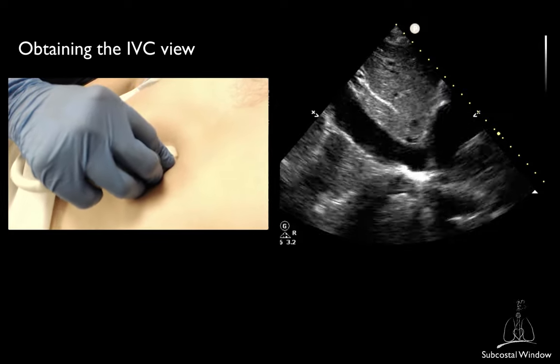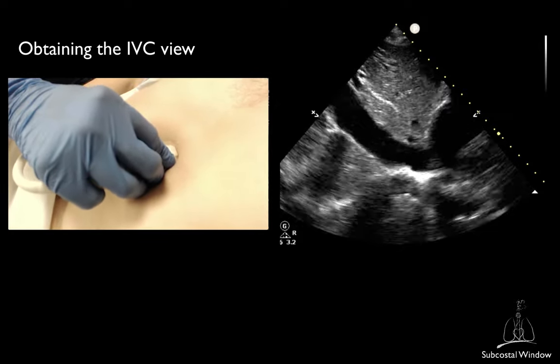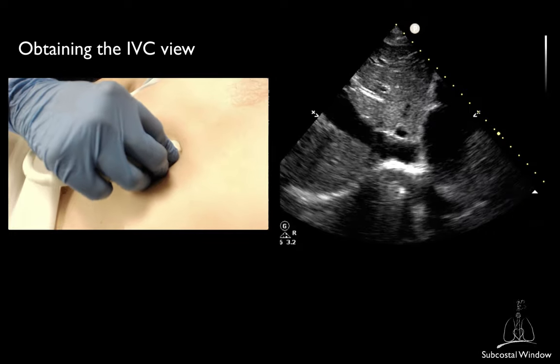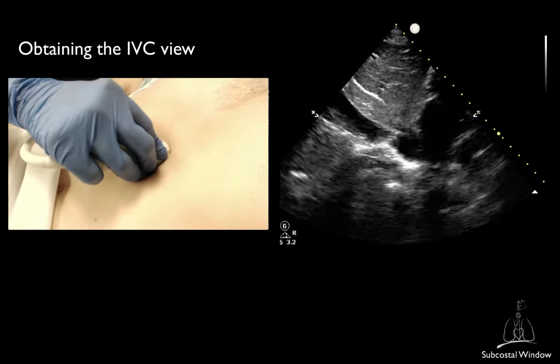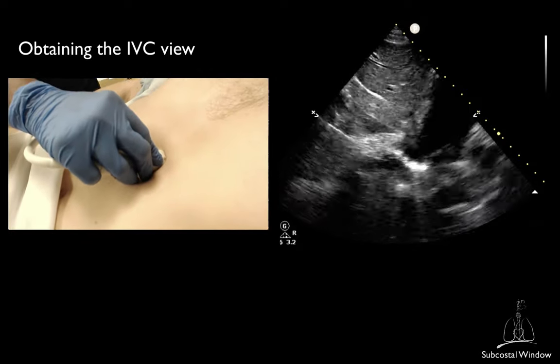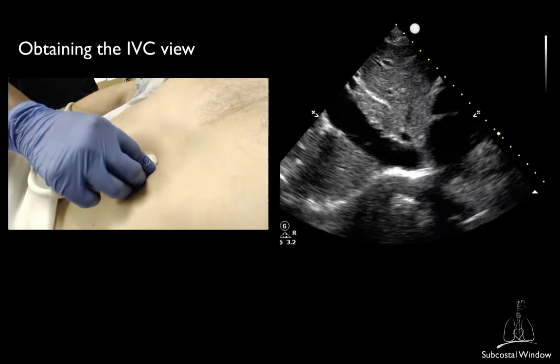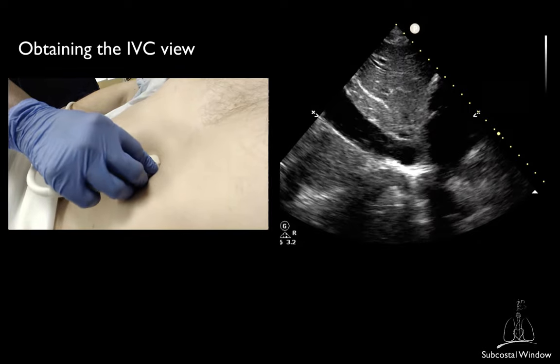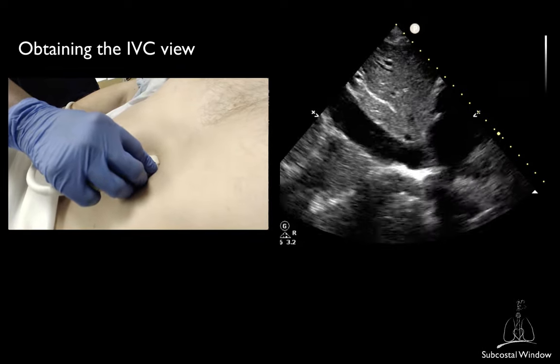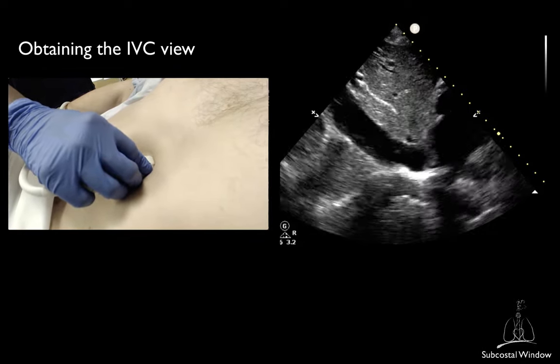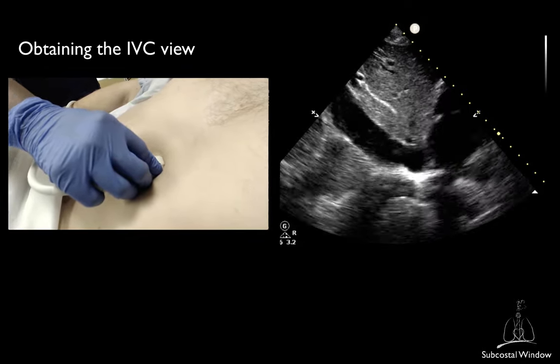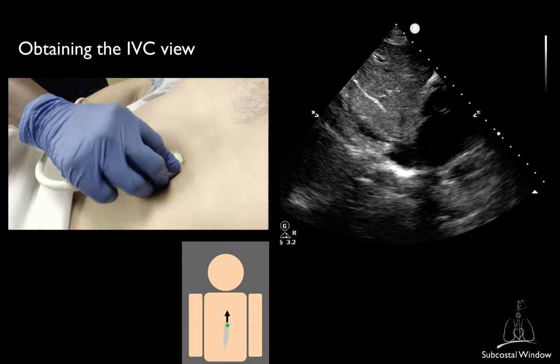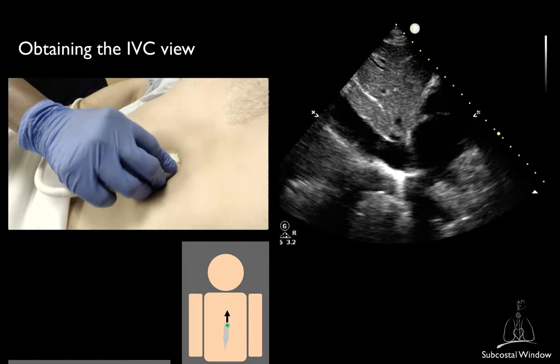Sometimes a slight tilting in either direction may also help. You should be able to see the IVC-RA junction and the hepatic vein. If you cannot see the IVC-RA junction, try to slide cephalad on the abdomen or rock the probe cephalad.